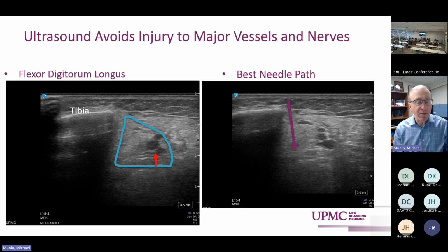The other thing that's not talked about as much is consistency. Especially, we do a lot of cervical dystonia injections. It's not the point of the talk now, but just as an example, muscles like splenius capitis, semispinalis capitis, and obliquus capitis inferior are in layers on top of each other. Oftentimes, if you're just doing EMG, you get some benefit, but when we say splenius capitis, we really want to be in the splenius capitis.